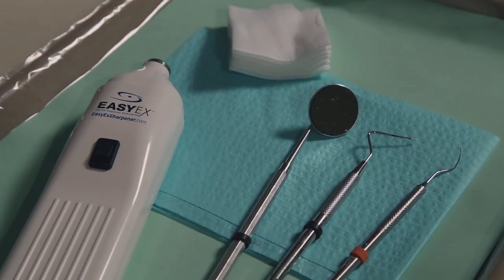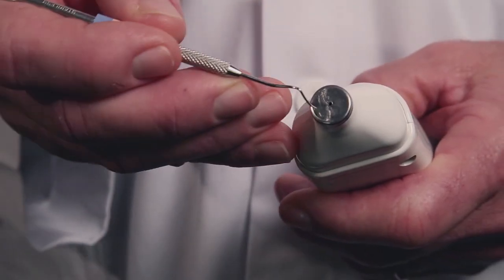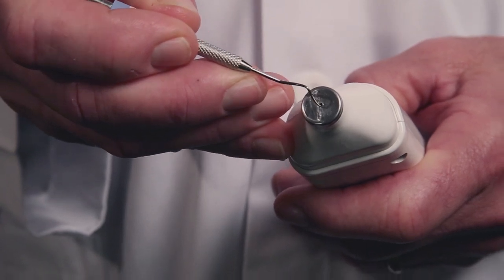Hello, I'm Dr. Tony Jewett, dentist and inventor of the EZX Dental Explorer Sharpener. The EZX is a handheld device designed to quickly sharpen your dental explorers by automatically honing them to needlepoint sharpness with just the press of a button. Think of it as a pencil sharpener for your explorers.